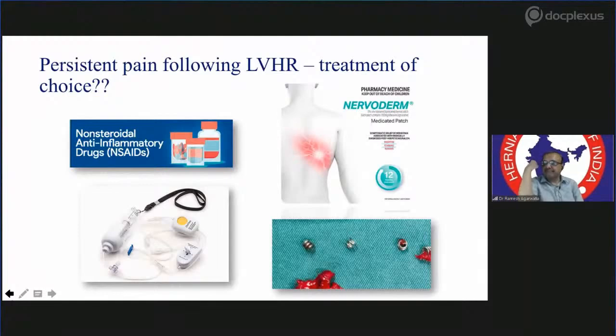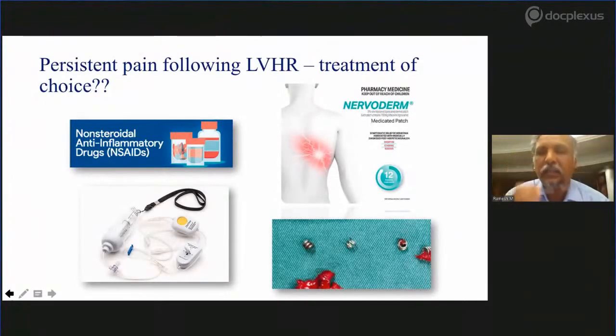I feel in a primary hernia, I don't really measure because I know the measurement from ultrasound. But in all secondary hernias, I certainly do that, because after you release all the adhesions and the fibrosis, there is definitely going to be a small change in the measurements. It's not going to be the same. So in secondary hernias, it's definitely important to measure.